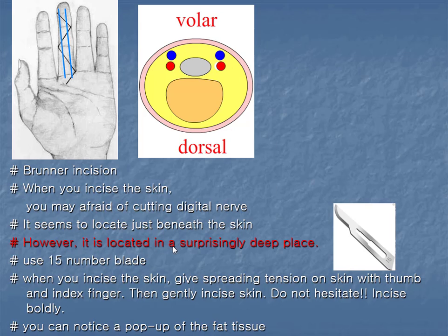is located in a surprisingly deep place. Use a number 15 blade. When you incise the skin, give spreading tension on the skin with your thumb and index finger, then gently incise the skin. Do not hesitate — incise boldly.